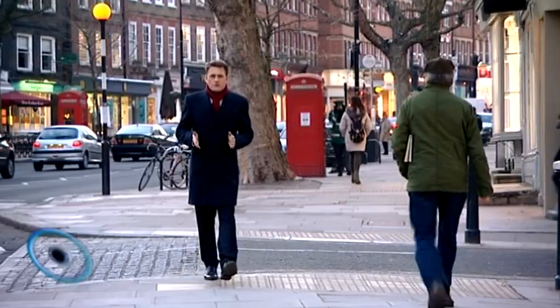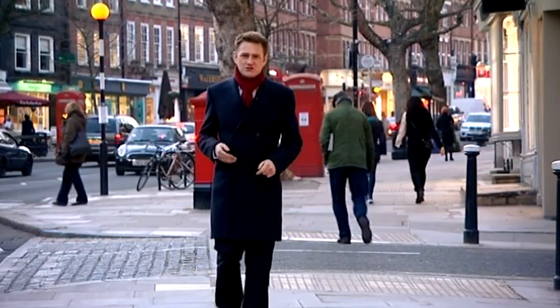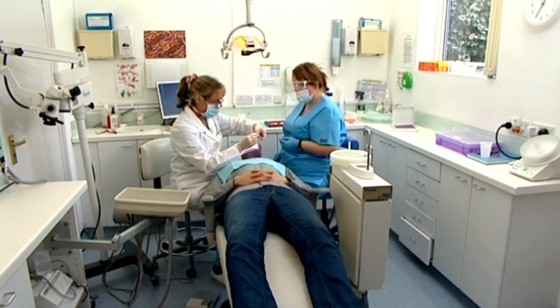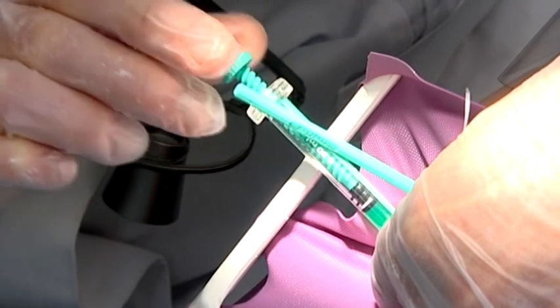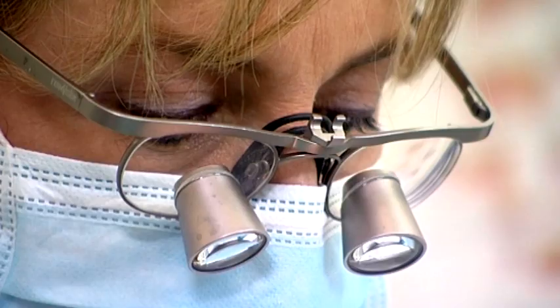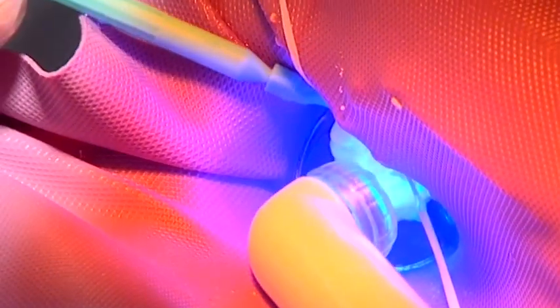Although the principle of prevention has long been taught in dental schools, the reality often failed to measure up. Now, though, the introduction of new technology is starting to make minimally invasive care an increasingly realistic possibility. ICON's micro-invasive infiltration technology can also help treat early tooth decay by preventing lesion progression and thus can increase the tooth's life expectancy. This is an alternative to having to use a dentist's drill.